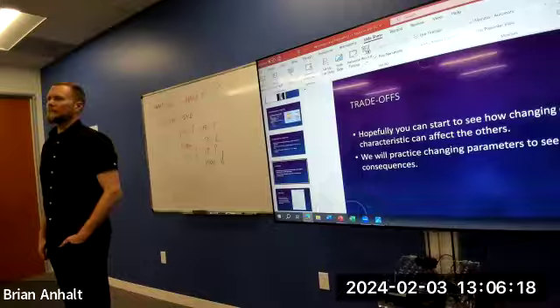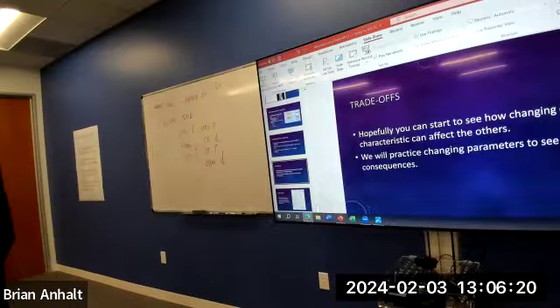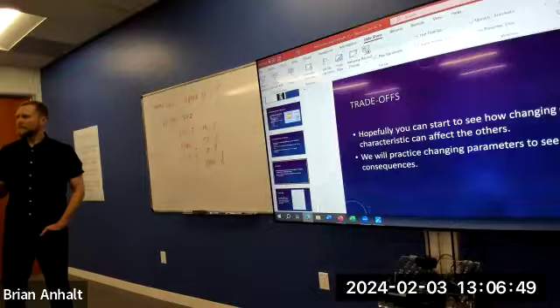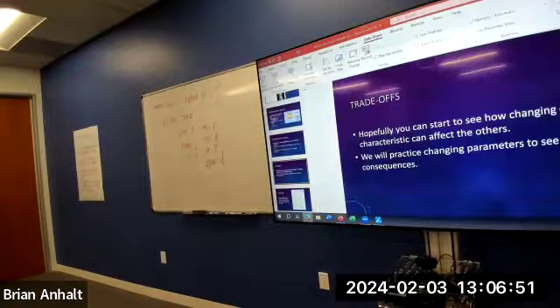Really? I got a 100% on that question. Do you want me to read it? Yeah. It says, if I have a fast spin echo sequence with a TE of 100 ms, TR of 3700 ms, ETL of 25, two signal averages, 30 slices, field of view of 240 millimeters, and a matrix of 512 times 512, what would the resulting scan time be? It's just giving you too many parameters. Yeah, you have TR, but if you use TR in those answers, it's not. Are you sure? I'm positive.